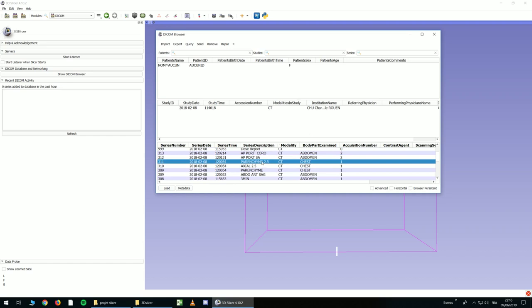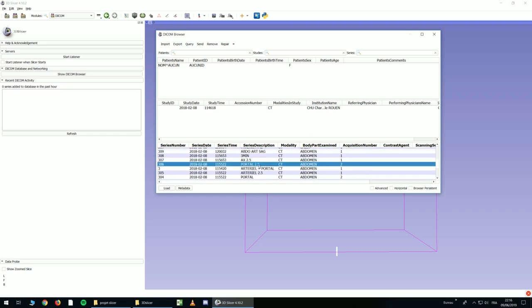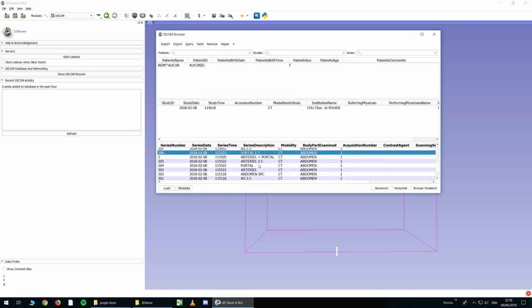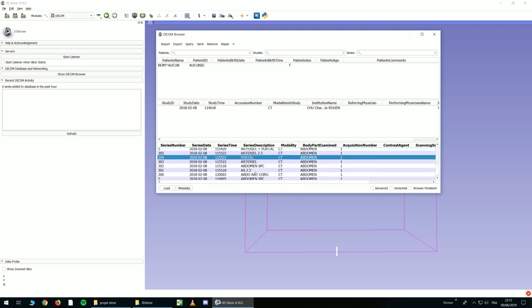If you don't need to be more precise, and if you want, for example, to do a liver volumetry, or if you just want to show something on a 3D view, you don't need a lot of precision. And you can use 2 or 3 millimeter slices, because everything will be much faster.